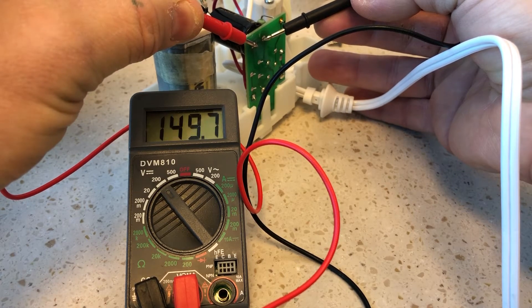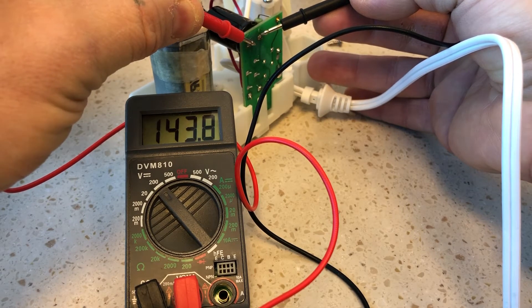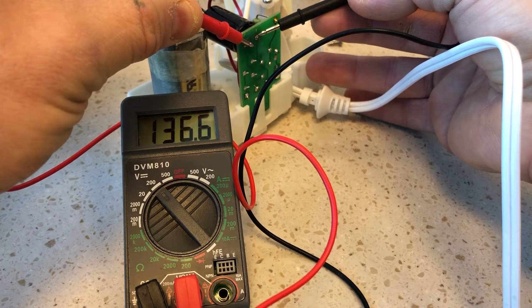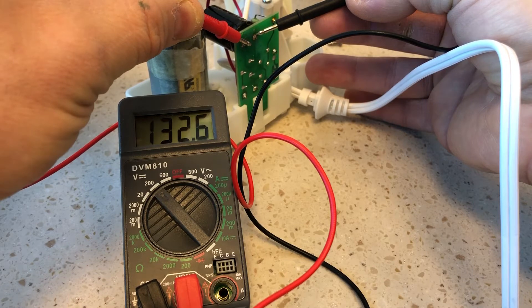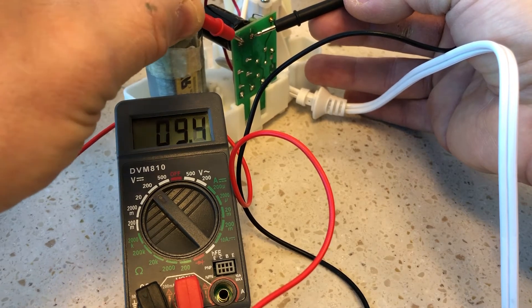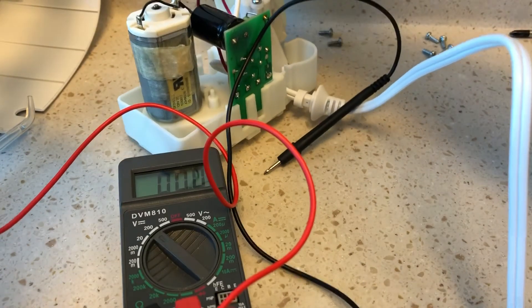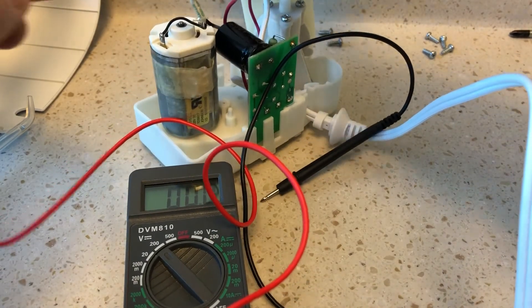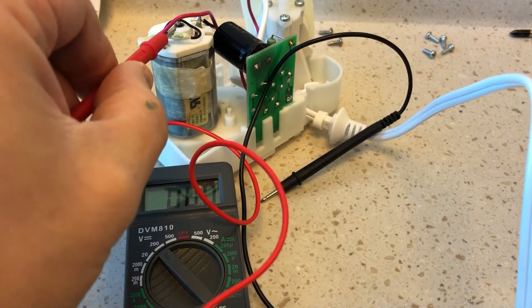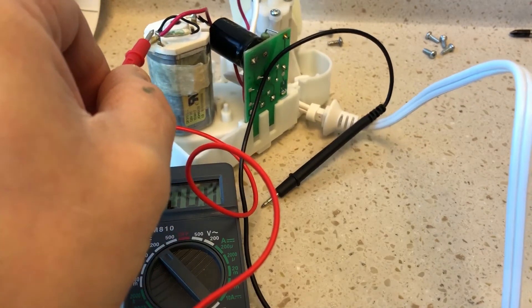You have to put something across here to bleed it. I don't know whether this is normal, if it usually stays charged like this for so long. It could be that once the fuse goes, it might be discharging to the motor. See, it was still running there — I have to short it to the motor and then it'll bleed the capacitor.